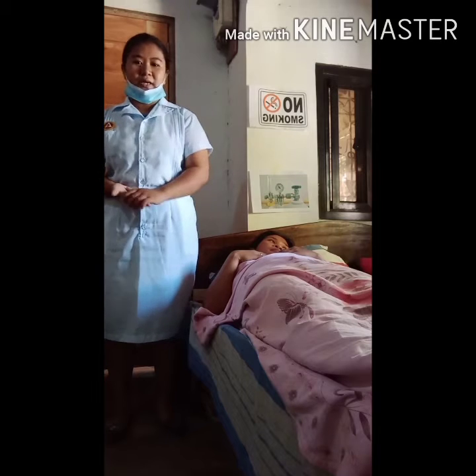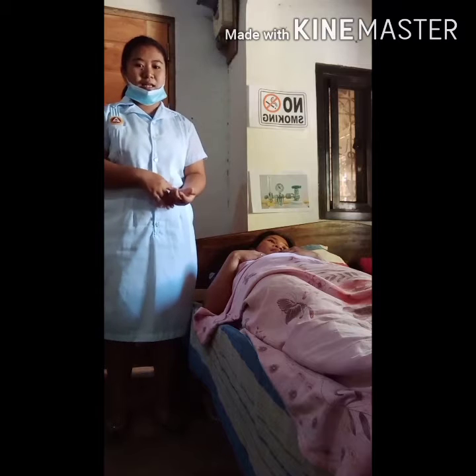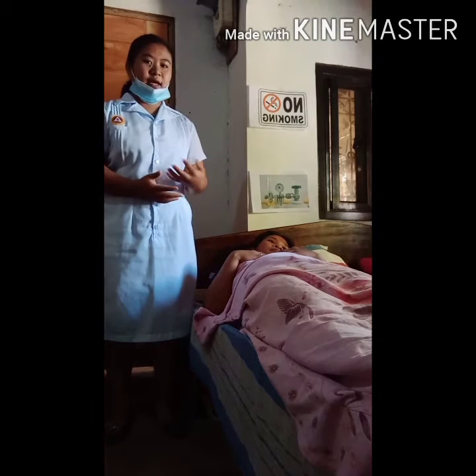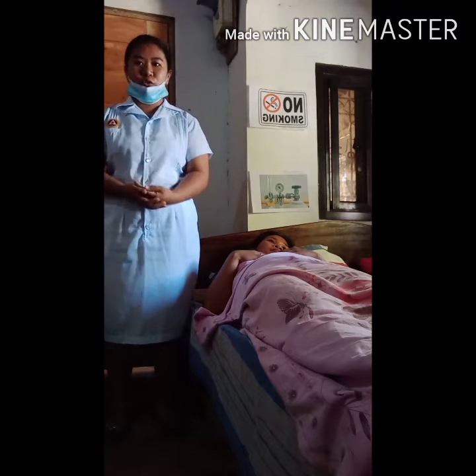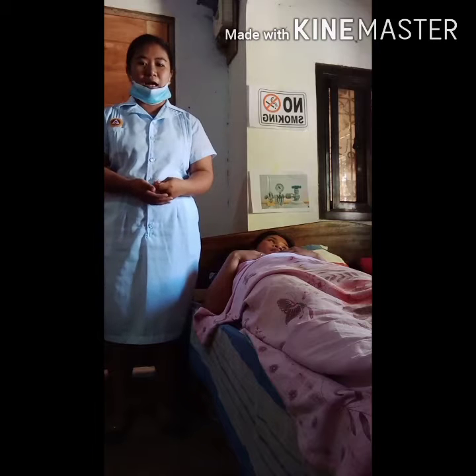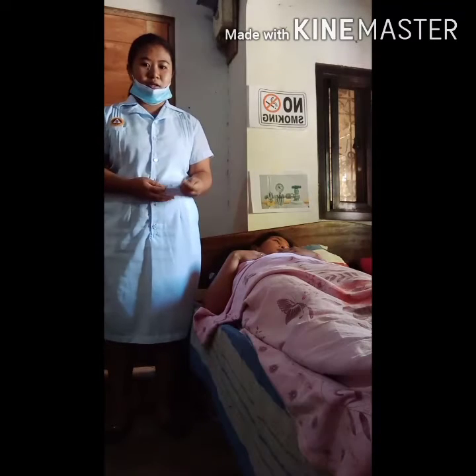So, this video is a demonstration of oxygen administration via nasal cannula. First, we have to indicate the purposes of the procedure. First is to deliver low to moderate levels of oxygen to relieve hypoxia. And number 2 is to allow an uninterrupted delivery of oxygen while the client ingests food and fluid.